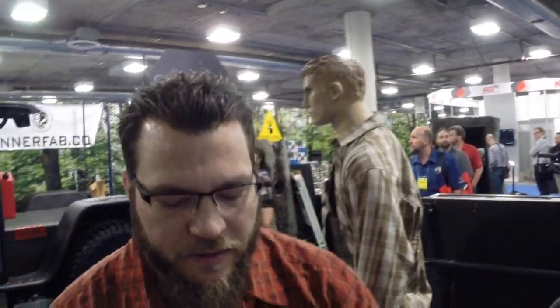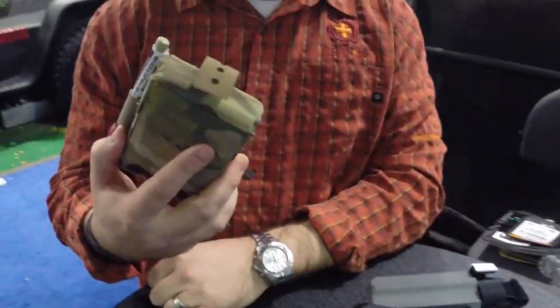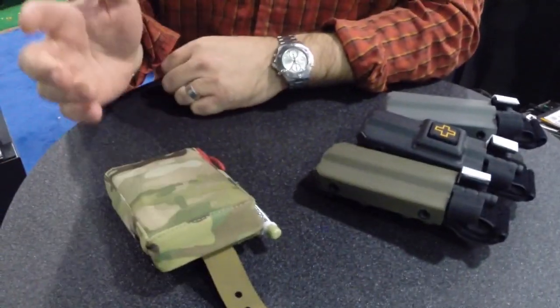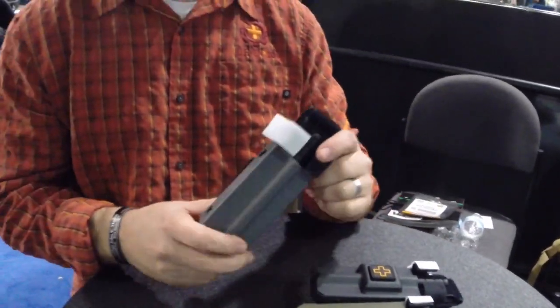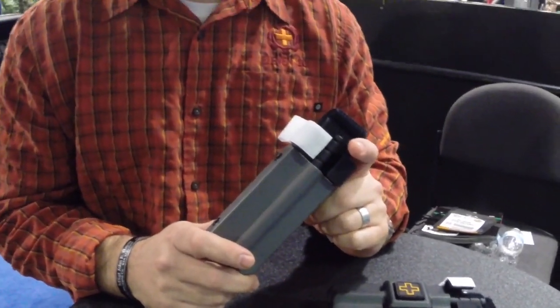Hey, I'm Bill Jansen with 1110. We just talked a little bit to you guys about the Clear Medical Mini, so go check out that video. But I wanted to talk to you today about the 1110 rigid tourniquet case for the CAT tourniquet.